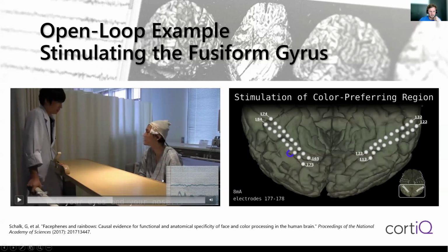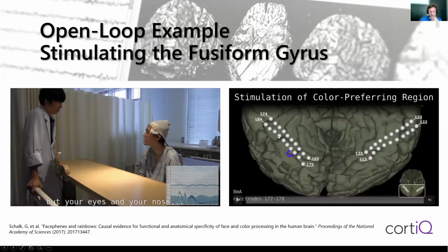So this is a nice example of how you can also use ECS based on a clinical procedure, also for research purposes, because in this paper, the ECS was related to high gamma activity in this region, and quite nice findings came up and were then published.